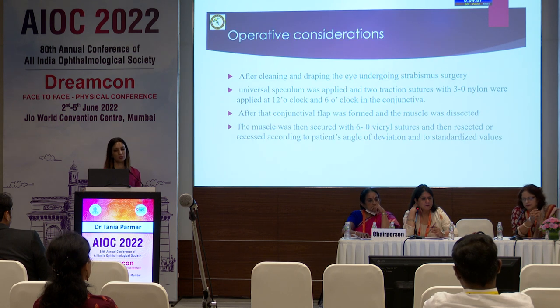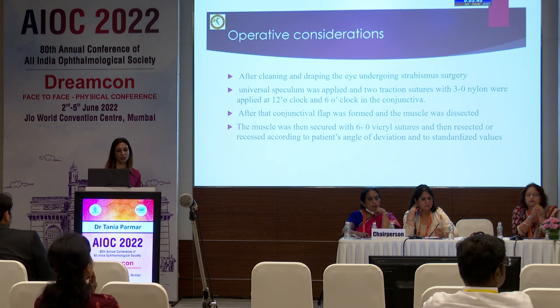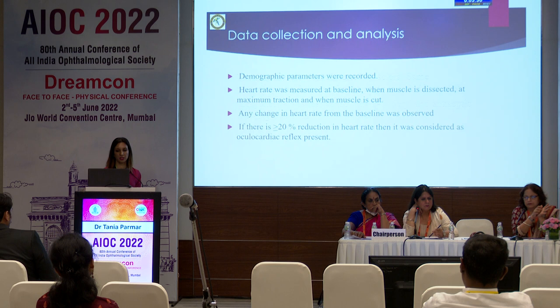Under operative considerations, we operated normally like we did in every patient. After cleaning and draping, a universal speculum was applied, and 2 traction sutures were given, which is 3-0 nylon at the 12 o'clock and 6 o'clock position. After that, a conjunctival flap was formed, and the muscle was dissected. Muscle was secured with 6-0 vicryl sutures, then recessed and resected according to the patient's angle of deviation and to the standardized values. Then the muscle was reinserted on the sclera. The same procedure was followed for the other muscle if required. The conjunctiva was reattached with 6-0 vicryl, and antiseptic dressing was done.